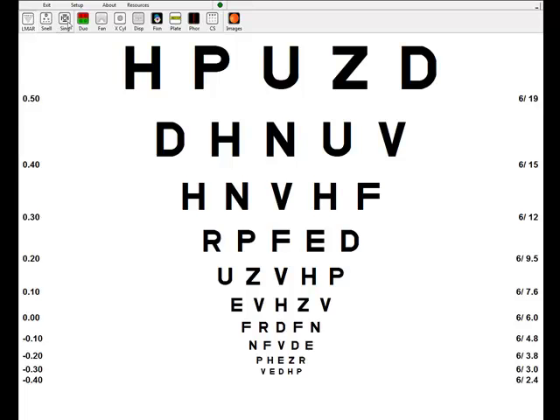There's logMAR chart, Snellen chart, single letters, duochrome, fan and block, cross cell, fixation disparity, fixation stimuli, number plates, registration plates, phoria tests, and contrast sensitivity. This option here will show a variety of clinical images for explaining things to the patient.